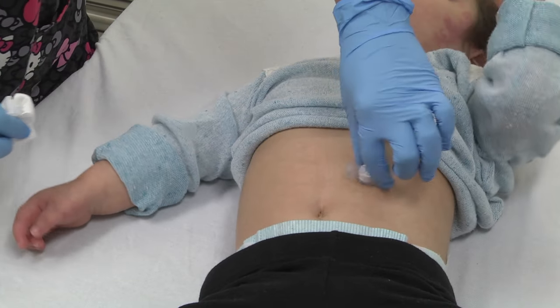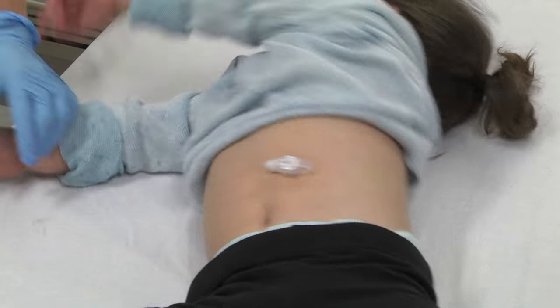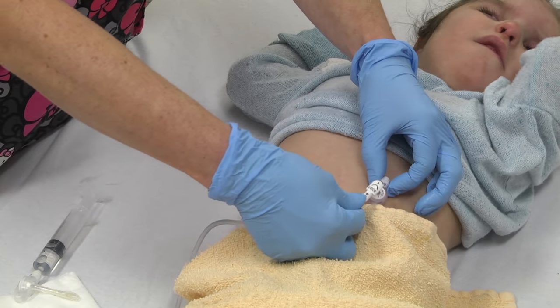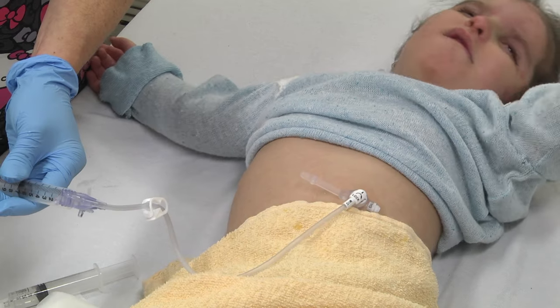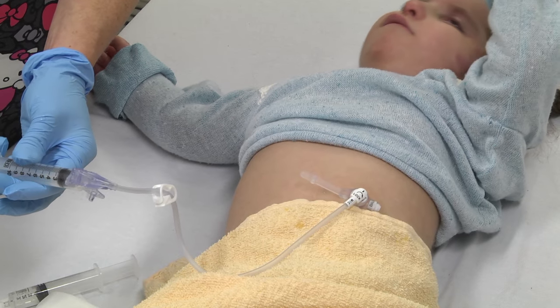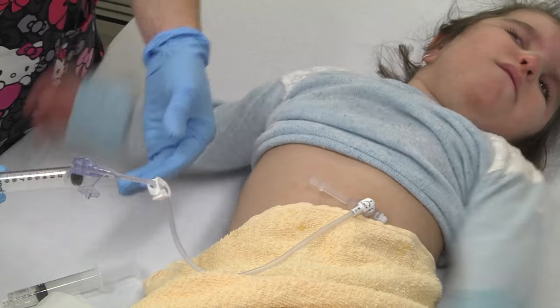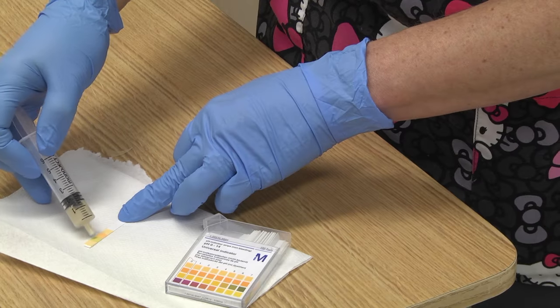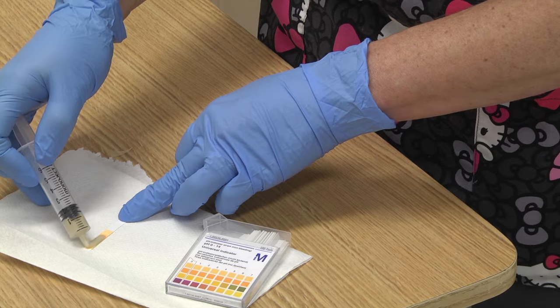Keep your finger on the plunger, then twist and remove the syringe from the balloon port. To verify placement, rotate the Mickey 360 degrees plus a quarter turn without resistance. Attach a feeding extension, pull back stomach contents, flush with water, and remove the extension.